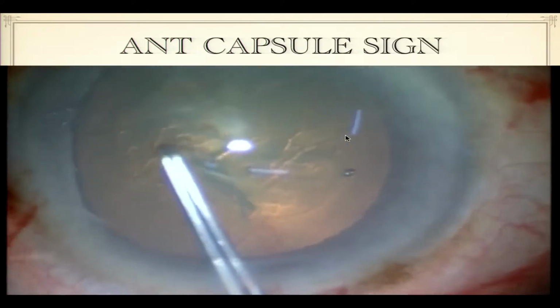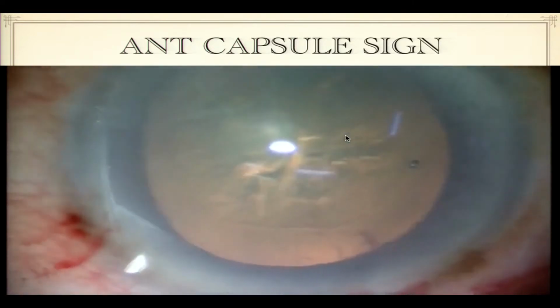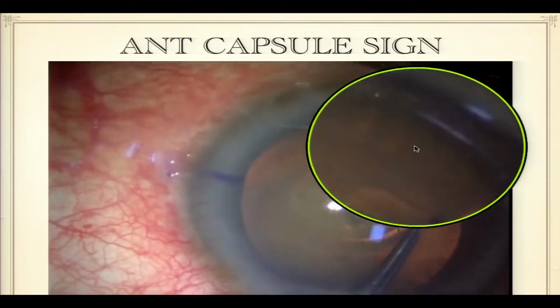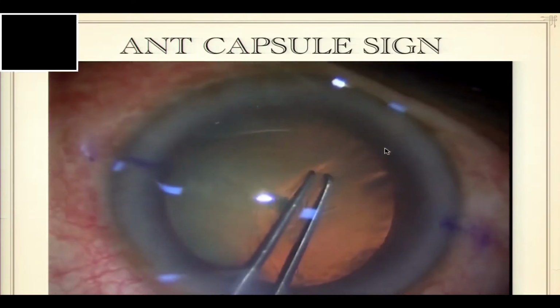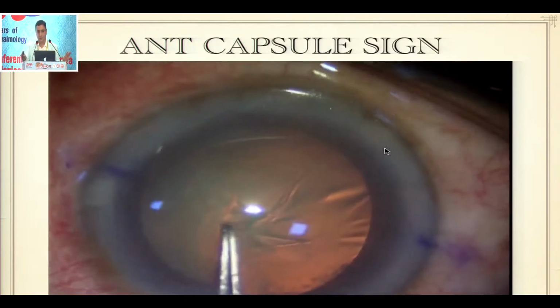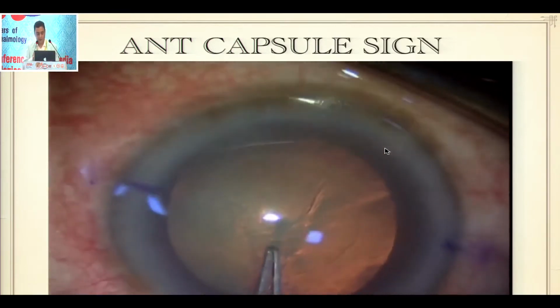Look at it, there is no traction coming from the zonules, and that's the reason why the folds are developing. Again, I'll show you one more case as to how the anterior capsule behaves. Again, look at the anterior capsule, and look at this area where all these folds are. You can see this area of the folds actually forming during the pull. So there is no counter traction, and that's the answer here: you will not see donesis, but there is no counter traction coming from the zonules, and that's the reason why the rexis is tricky.